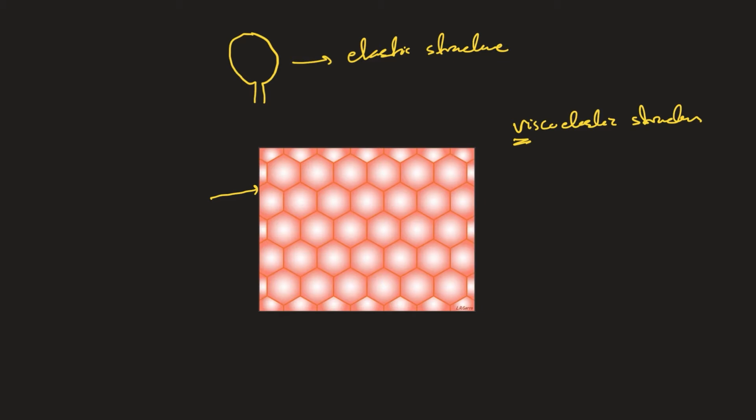What does this mean? We always give you the example initially, at the beginning, we say, oh, it's like a balloon: you blow it, the balloon gets bigger in size, and you deflate the balloon, it gets smaller in size. But at the alveolar level, this can be different.